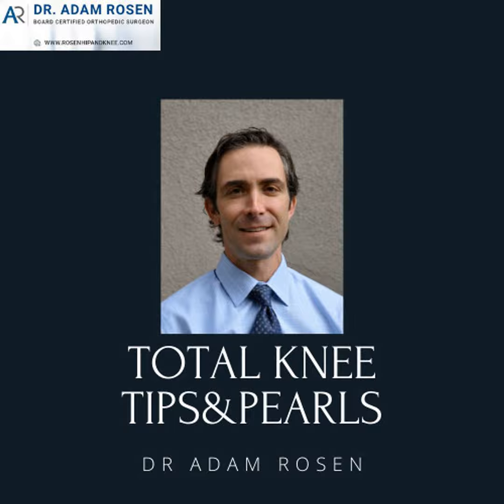So at this point, typically I'll flex the knee up. But if the knee is tight, you have to be aware and cautious with your extensor mechanism. So, a couple of options. The simplest option is just to extend your arthrotomy up. You may have to go further up the quad to release it. Let's say it's tight, but not so tight that it's going to damage things, but you're afraid you may be at risk of the patellar tendon. Some people will use a staple, or a spiked washer with a screw, to protect it.